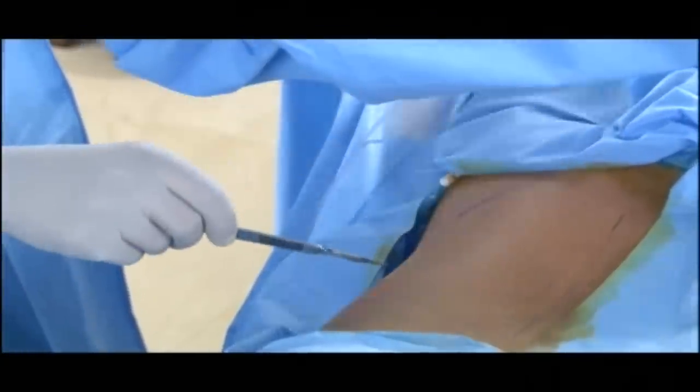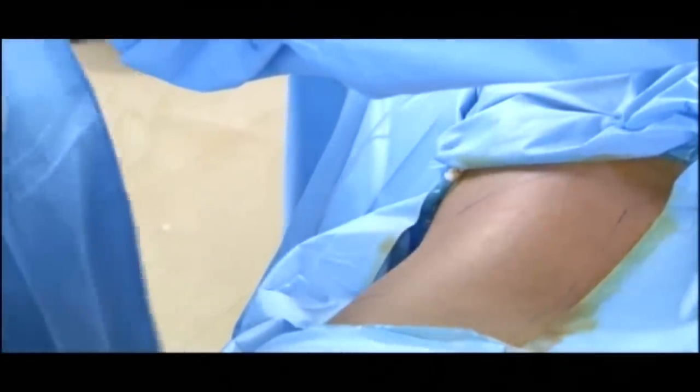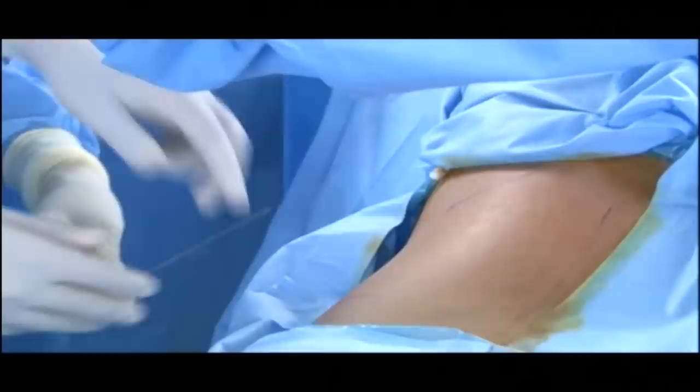Are you seeing my needle there? Yes. So I have placed my needle here. Now, on the surface, I will take a stab here. Lower pole kidney, lower pole puncture — you have to be careful that the kidney generally tends to buckle, because there is more fat at the lower pole of the kidney.